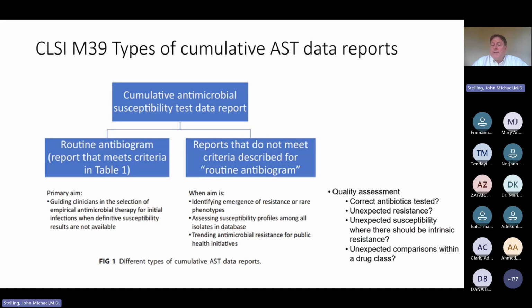That was recommended in the 1990s, early 2000s, but it was found to be a good test, but problematic, especially with regards to a certain subtype of Staph aureus. So if I see Staph aureus with oxacillin disc results, that's a mistake. You should not be testing the oxacillin disc. You should instead use the cefoxitin disc or an MIC test.